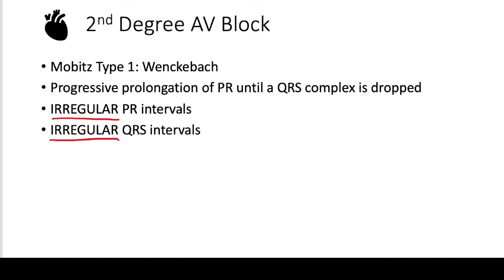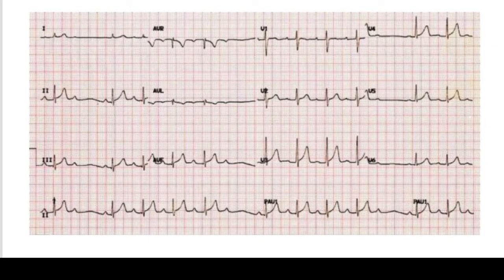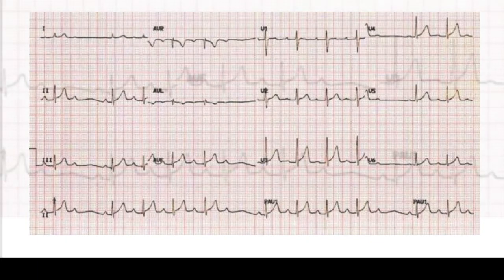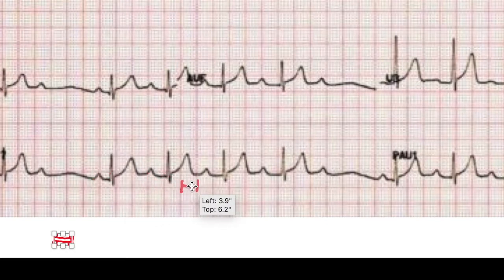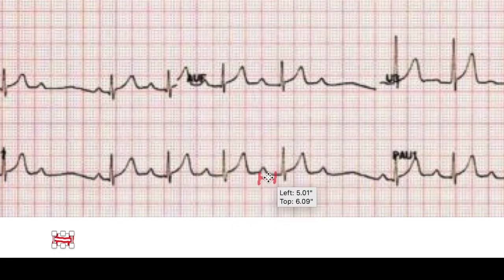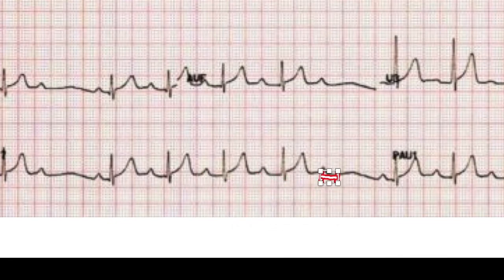Looking at this example, starting with the second beat, the first PR interval is shorter than the next, and each subsequent PR interval is progressively longer, until on the fifth beat you have a dropped beat. Measuring the QRS complexes confirms they are also not at regular intervals, consistent with Wenckebach block.